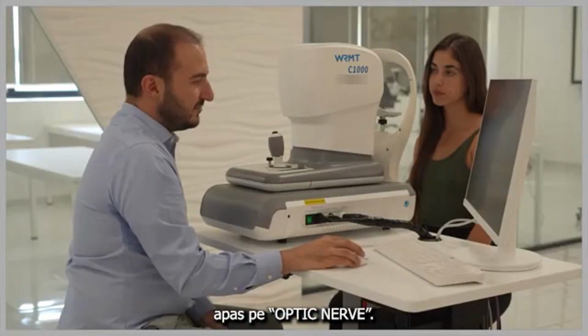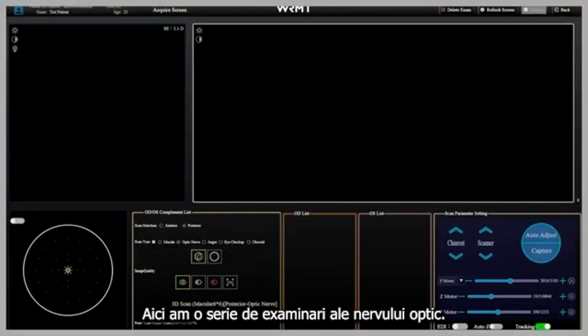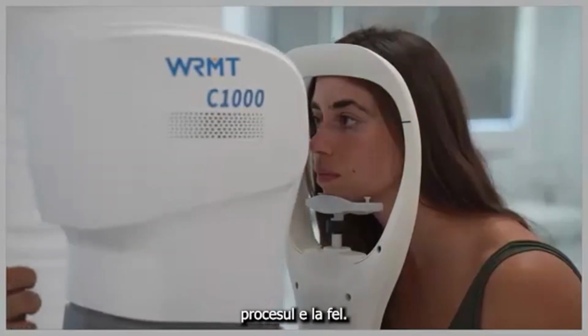For the optic nerve analysis, I click on optic nerve, and here I have a series of examinations related to the optic nerve. The first one is the 3D scan on the macula. I double click, and when I do this examination, it's the same as the other ones.